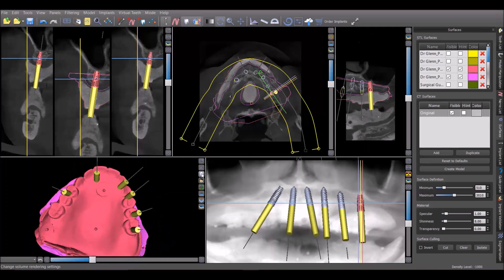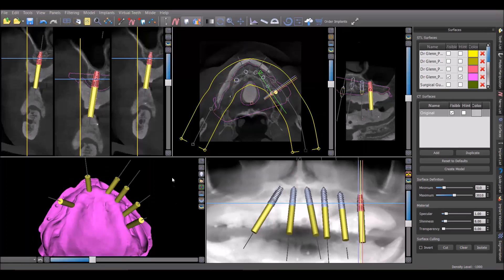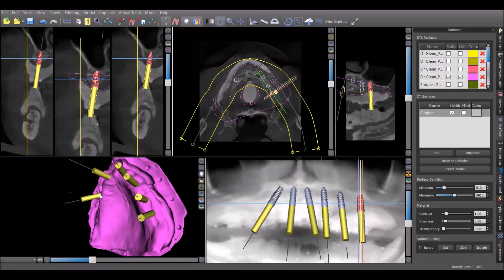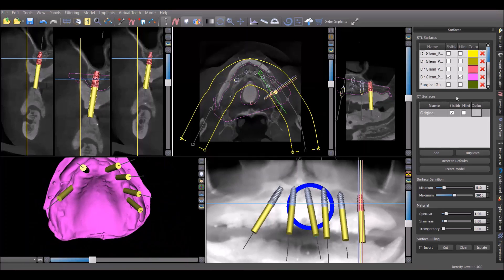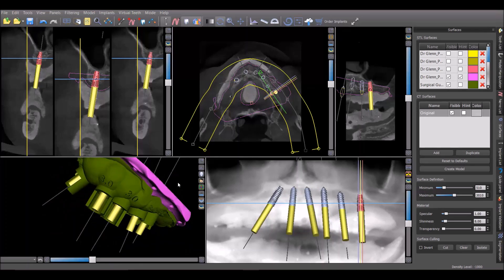The beauty of this scanning protocol is that we can actually turn off the denture model and see where all of these implants emerge through the tissue. They all look like they're going to be in good keratinized gingiva, and from there you can create the surgical guide.